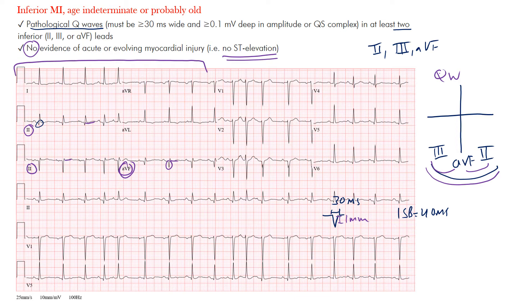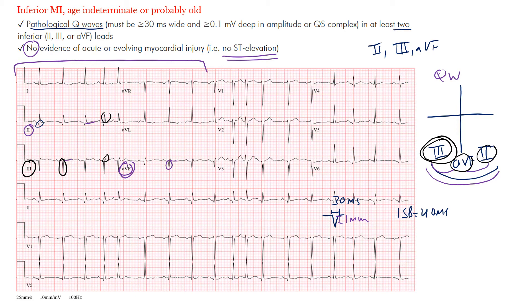No ST elevation in any of these leads, which would represent acute or evolving myocardial injury. In lead III, notice these deep Q waves — quite prominent — which may suggest that the region of the heart where lead III sits may be more infarcted. You see very small positive deflections in that region compared to lead II, likely because that area is infarcted. So it's most prominent in III, then AVF, then lead II.